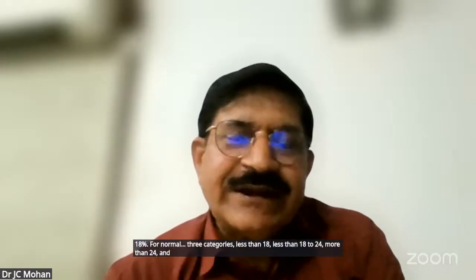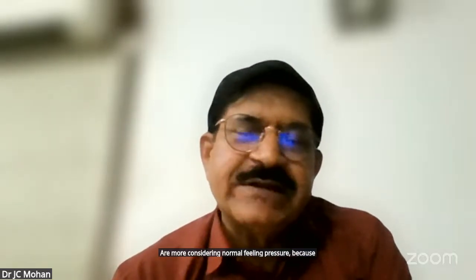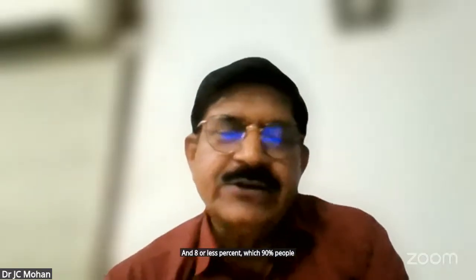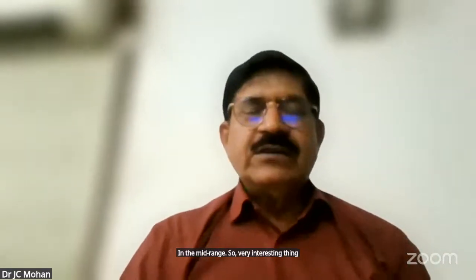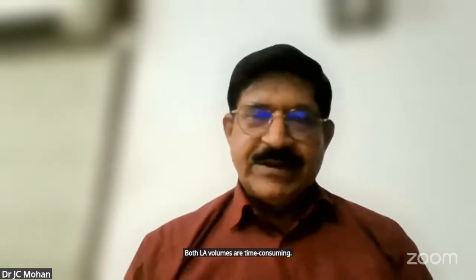And then left atrial contractile strain of 14 or more, considering normal filling pressure, because they mentioned 92% of patients have normal filling pressure. And 8% or less, where 90% of people have elevated filling pressure. 8 to 14, of course, is the mid range. The only difficulty with all of that is we also realize both LA volumes are time consuming. You have to do it biplane.